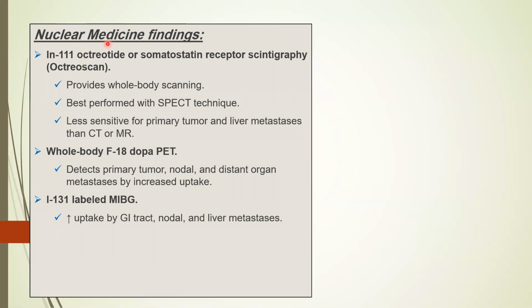The most important and widely performed is the indium 111 octreotide scan.